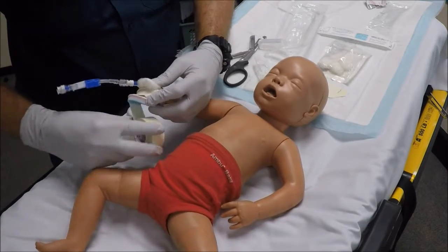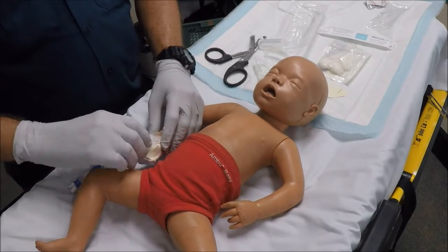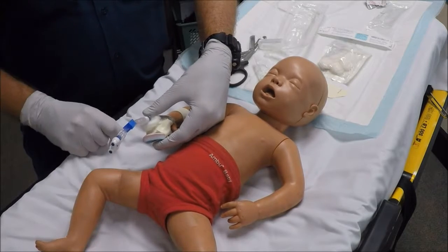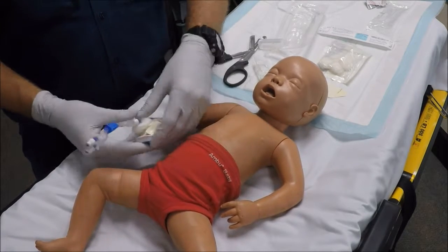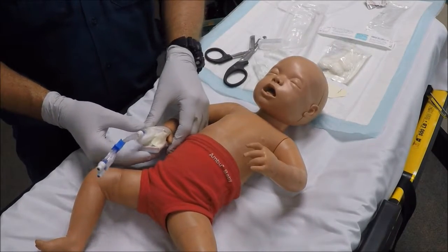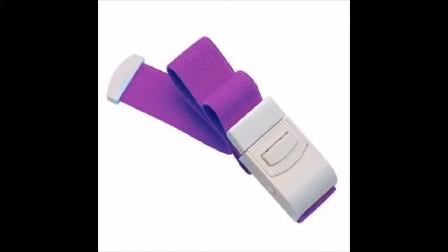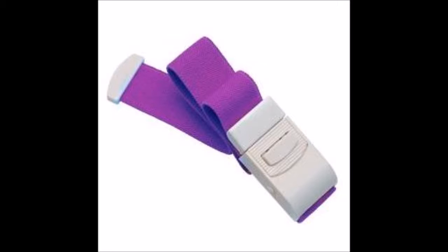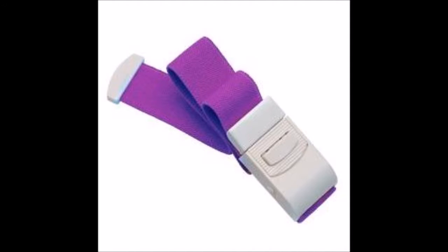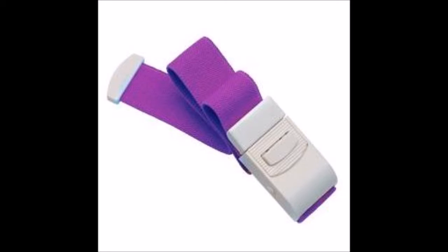The cannula is secured above and below, and checked at least every hour to ensure patency and to check for potential pressure injuries. It may also be pertinent to strap the other hand to prevent the patient from pulling the cannula out. If a tourniquet is used during paediatric cannulation, it's important to note that children require lower tourniquet pressures than adults, and arterial flow must not be occluded. If a tourniquet is applied above the elbow, this can be confirmed by checking for the presence of a brachial pulse.